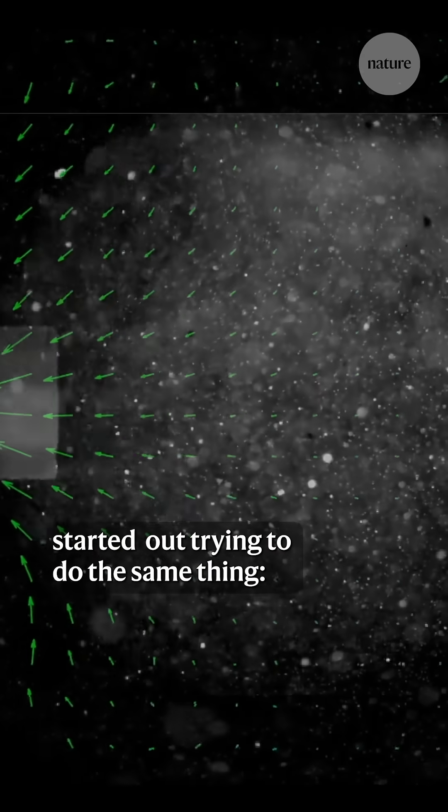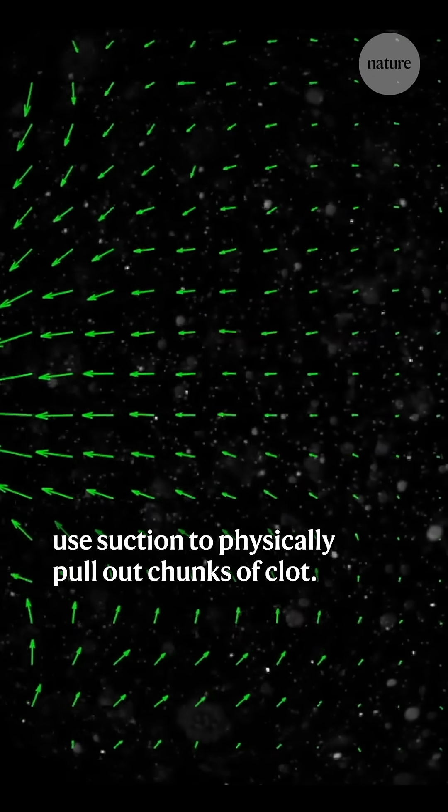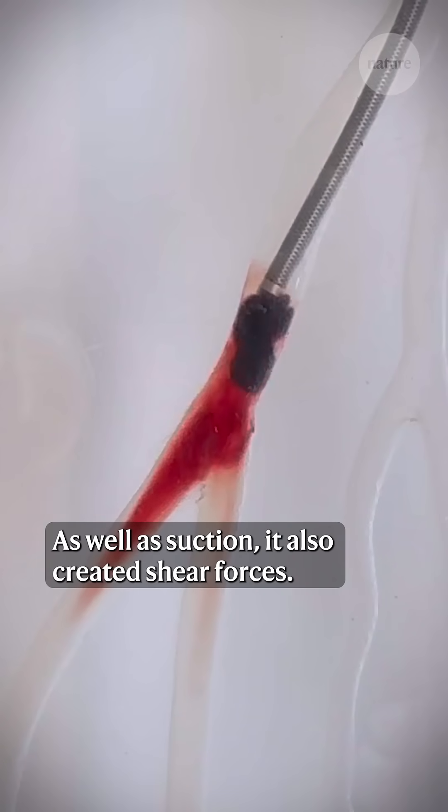The team behind the millispinner started out trying to do the same thing — use suction to physically pull out chunks of clot — but the spinning motion that they were experimenting with had another unexpected impact. As well as suction, it also created shear forces.